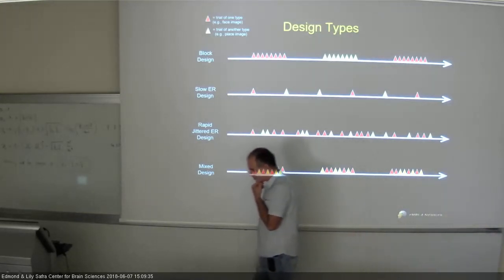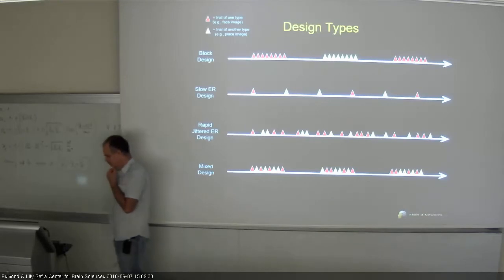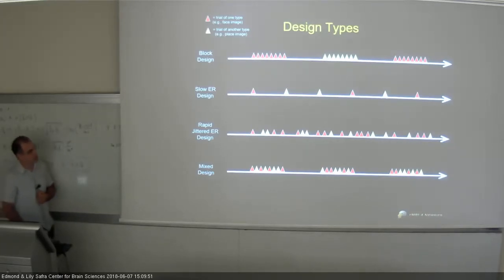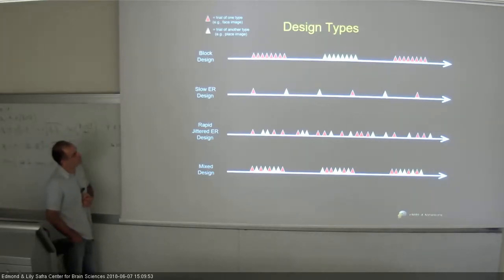So let me first introduce the lingo, the main design paradigms that people use. We'll go over and understand the logic behind each and every one of them, and also understand some other things about the BOLD signal, some other features or the nature of the BOLD signal.